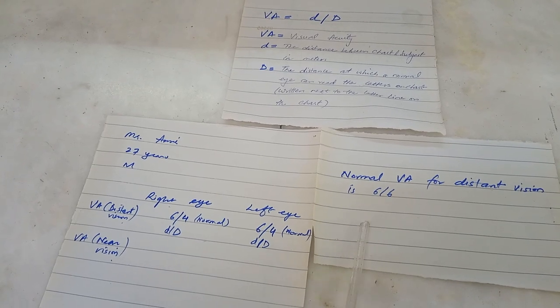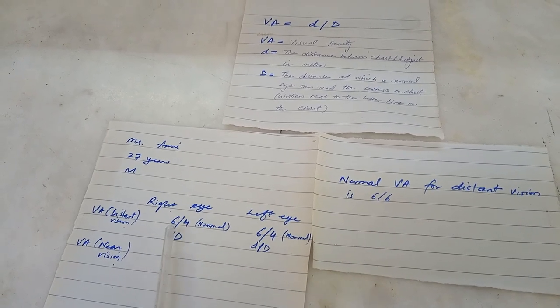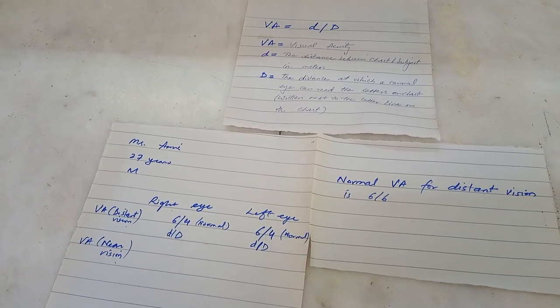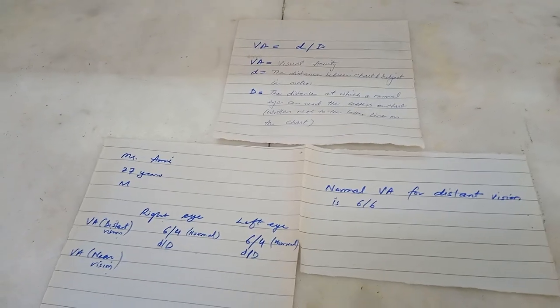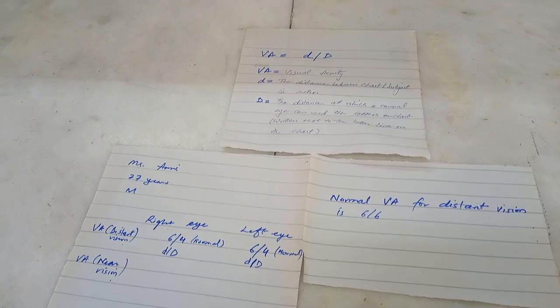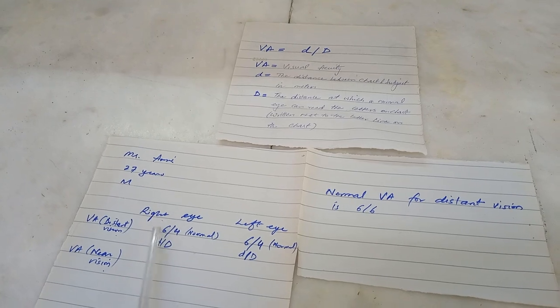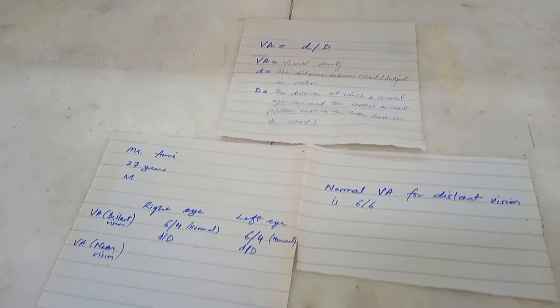Normal is up to 6/6. However, if it is 6/5 or 6/4, it is also normal. It means that what is normally seen by a normal person at a distance of 4 meters can be seen by Mr. Amir at a distance of 6 meters.